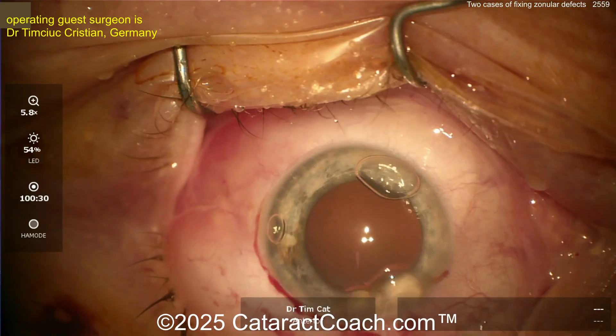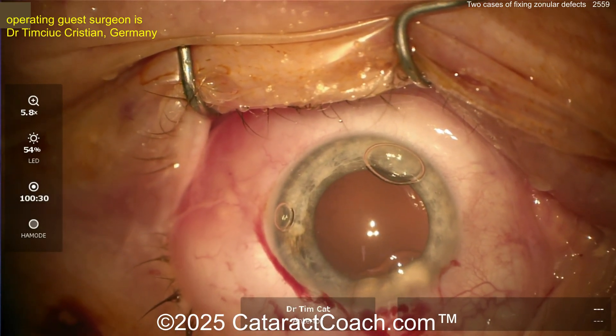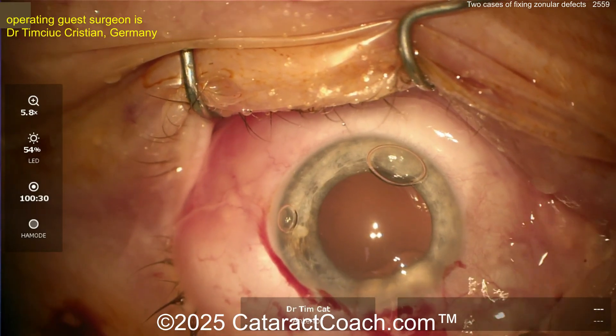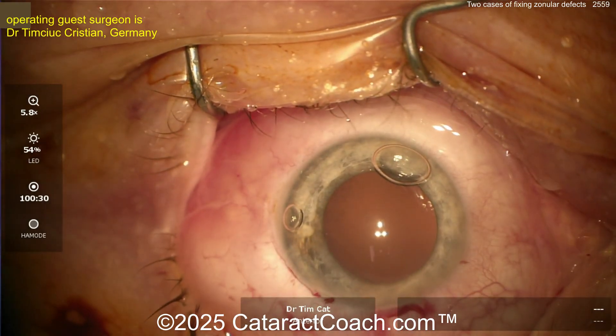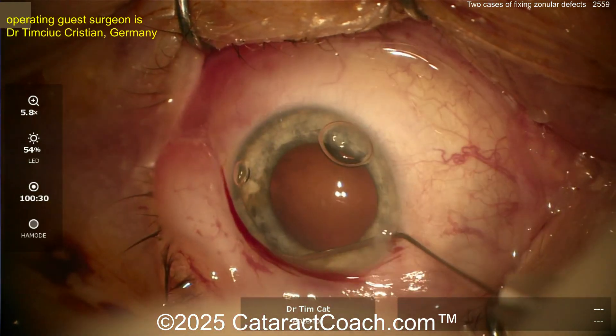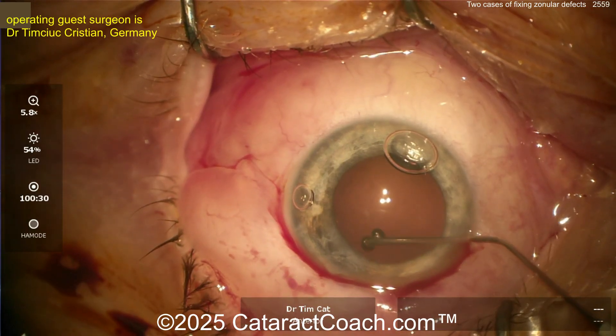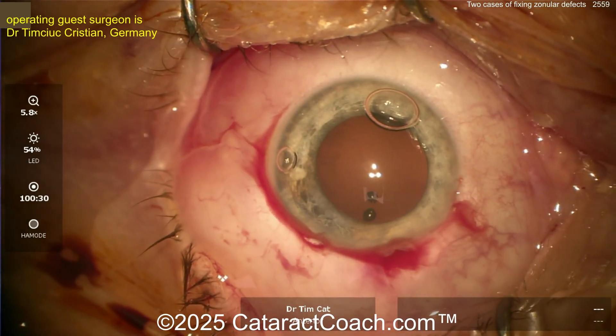Stabilize with viscoelastic — I like that idea, very good. Get that viscoelastic in, push that bag back out; don't worry about any little bit of cortex at this point. Now the question is: is a single CTR going to be enough to stabilize this? With six clock hours or more of loss, you need more than just a CTR. Three clock hours, like the previous case, a CTR is plenty — but here you may have to do something else.